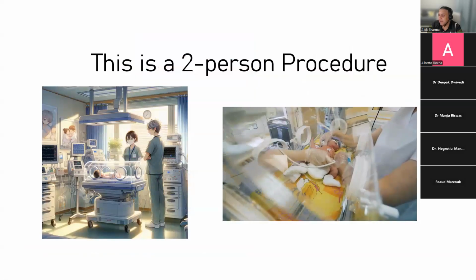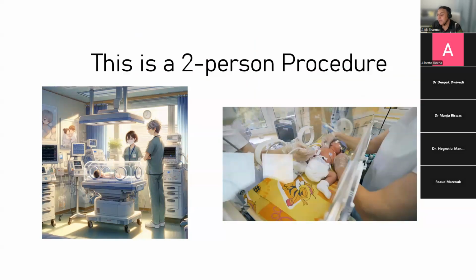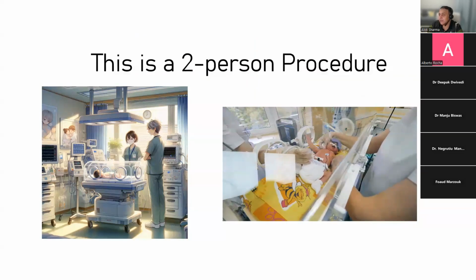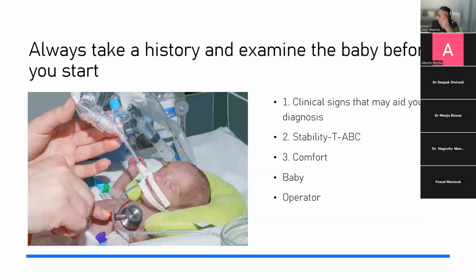So just have a powwow with whoever's going to help you. Don't pull them off looking after another sick baby if the scan is just a routine scan that needs to be done. They may have time pressures and elements of work that they have to do. So just be kind. Always take a history and examine the baby before you start.